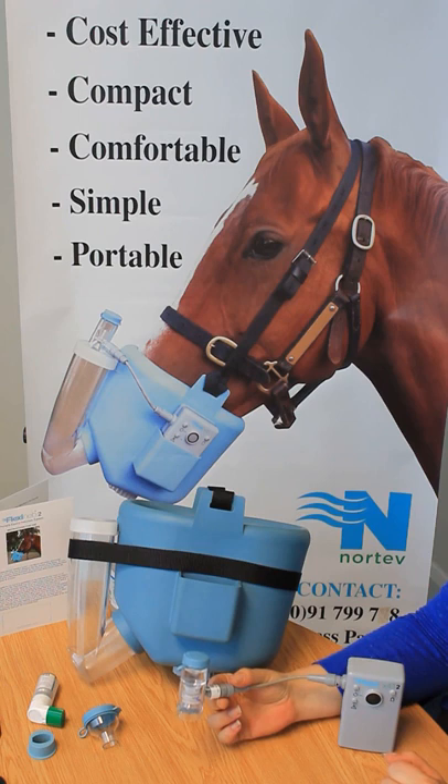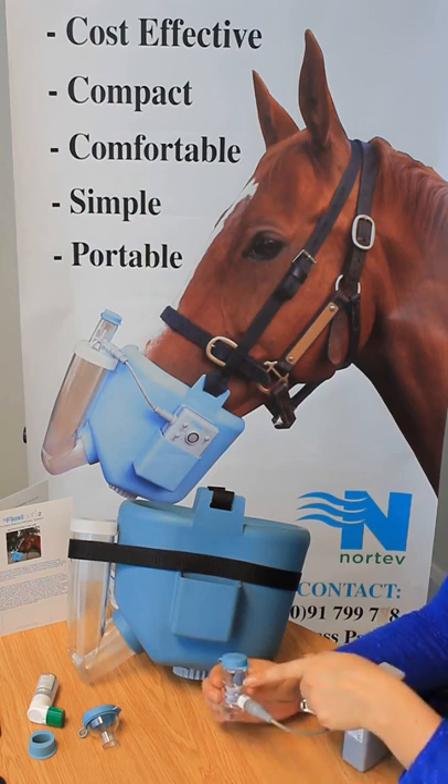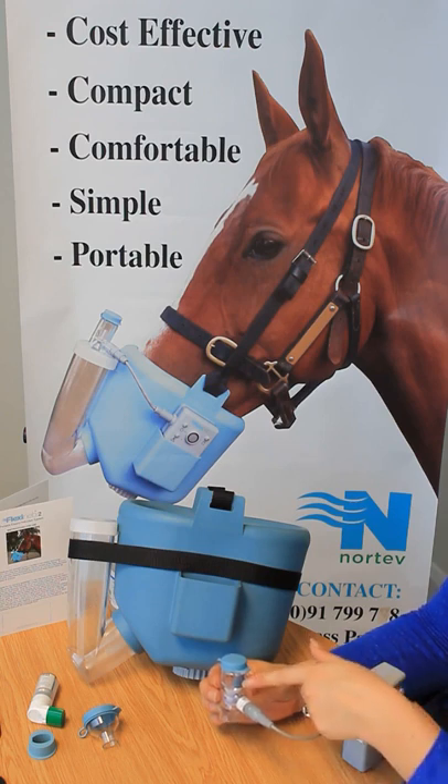We have three different variations of cup. This is identified as a grey cup. We also have a green cup, which is identified with a green sticker, and a blue cup, which is identified with a blue sticker.